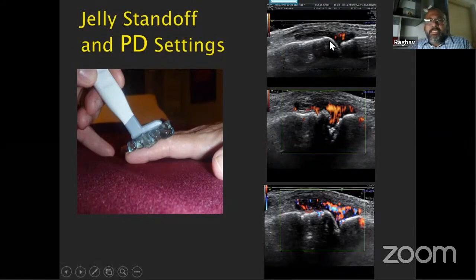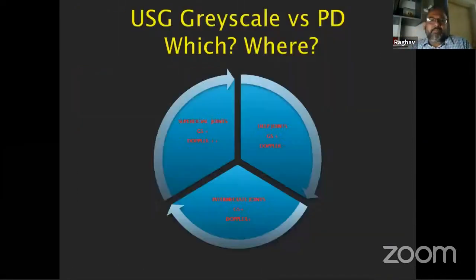What I cannot visualize is anything below an intact healthy cortical bone. What I can visualize is anything above that. So in the ankle, anything above the joint and the bone, whatever is accessible with the ultrasound, will always add to the information which has been acquired from the other imaging modalities. Adding to it, the Dopplers are useful in pointing out the inflammatory process and the vascularity.